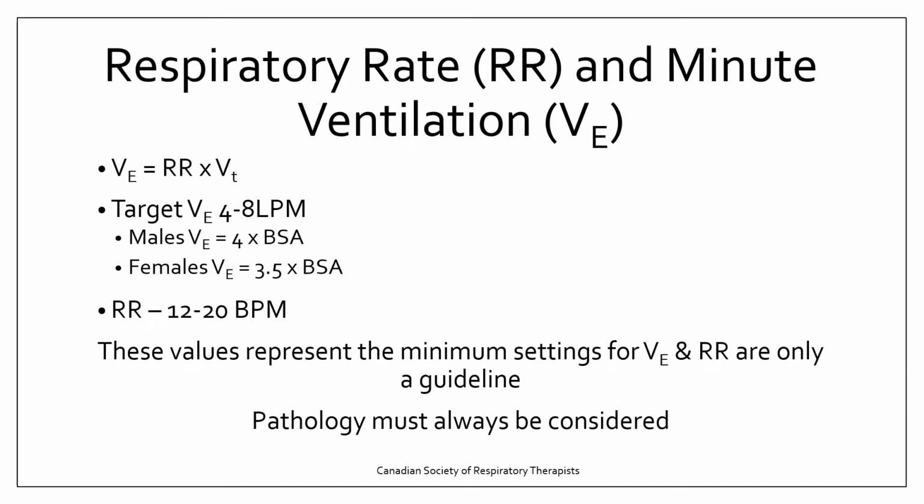Another component that you're going to set is respiratory rate and really minute ventilation. So determining our tidal volume is easy. We have a good milliliter per kilogram normal ratio that we'd like to use, right? We want to use somewhere in around those 6 mils per kilogram range.